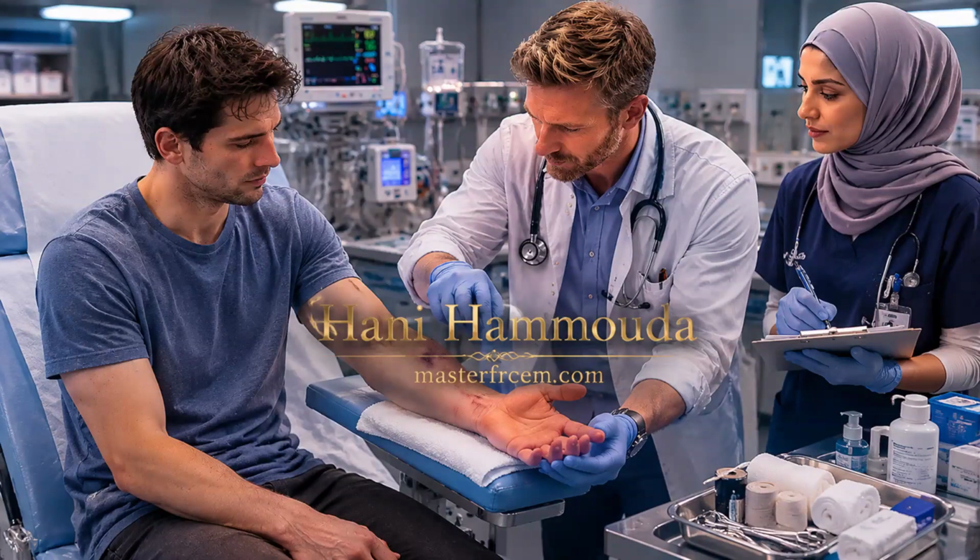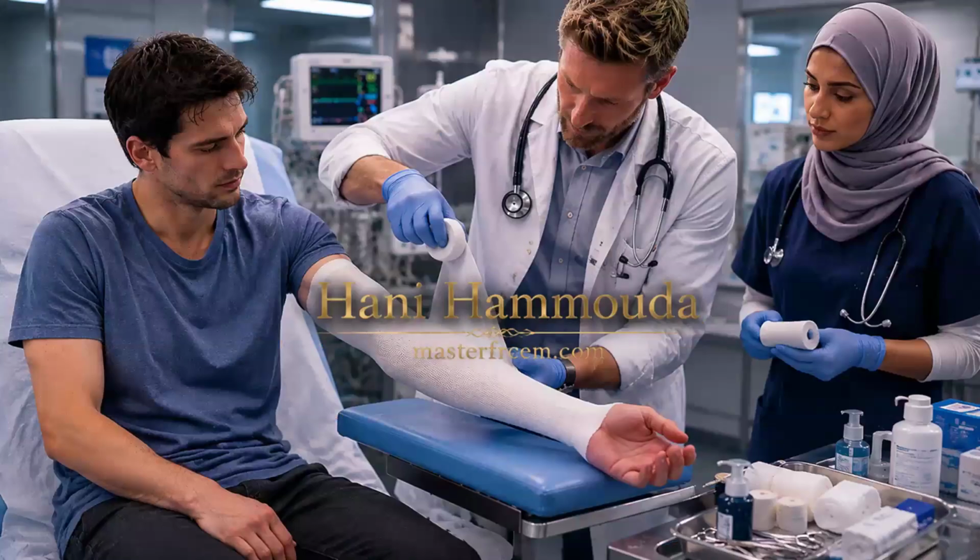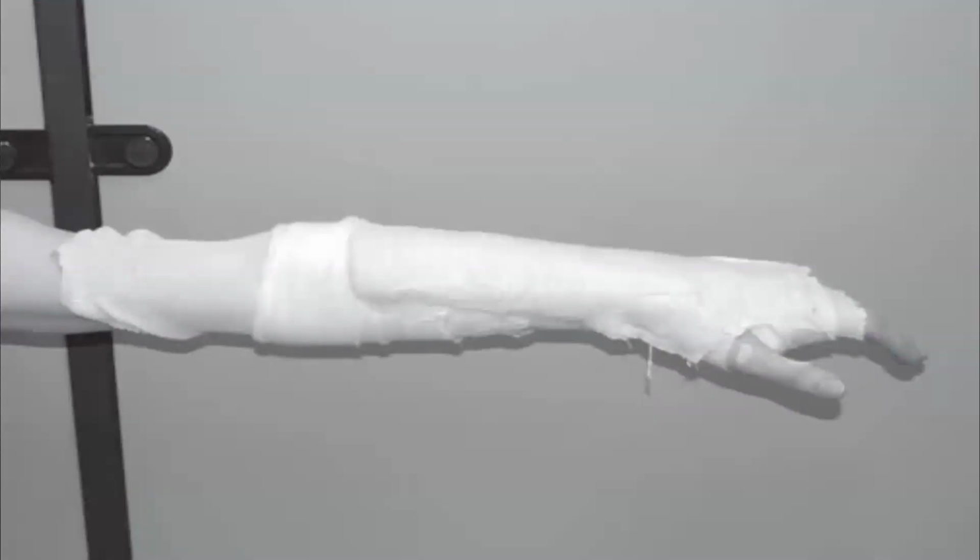Now I'm checking the radial pulse. Okay, radial pulse is intact. Okay, good. Now moving to the procedure itself. So I am going to extend the patient's arm while the patient is sitting in a chair. I will apply first the stockinette above the elbow by 10 centimeters and below the metacarpophalangeal joints by 5 centimeters. Then I will apply cotton pads from the elbow to the metacarpophalangeal joints. Then I will move to the plaster bandage. I will measure it from the metacarpophalangeal joints until 5 centimeters below the elbow.